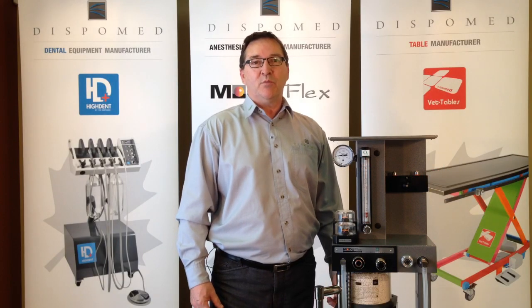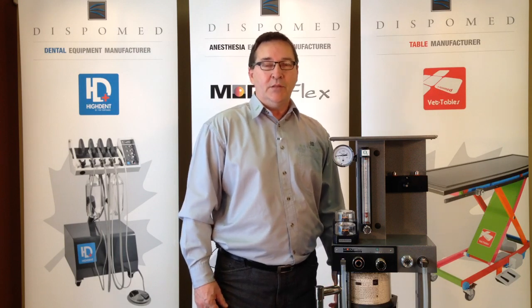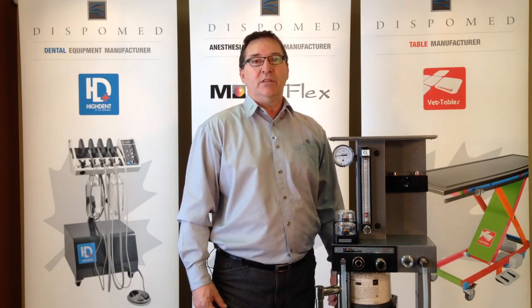Hi, welcome to another Dispomed video. Today we will be looking at how and when to replace the soda sorb in your anesthesia machine.